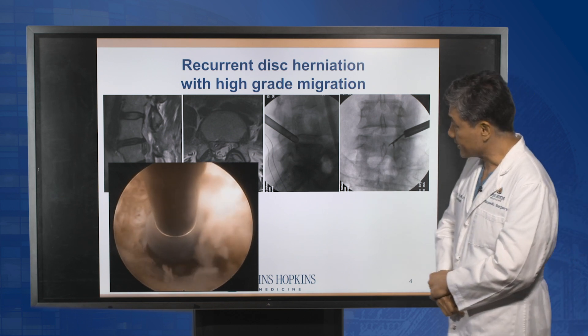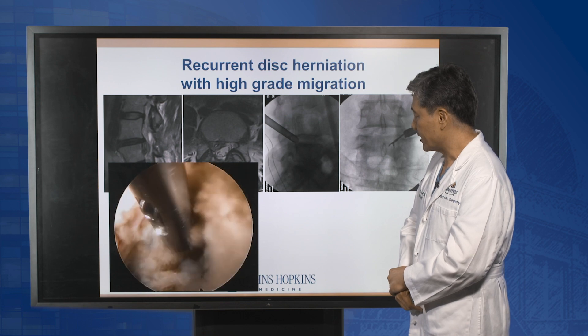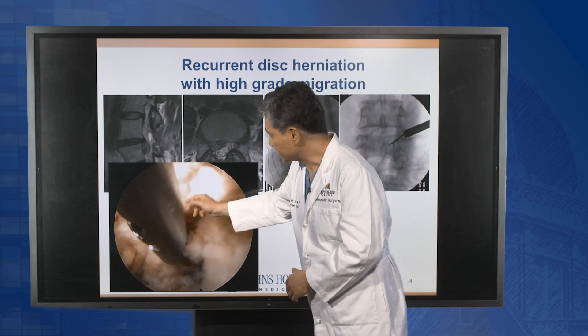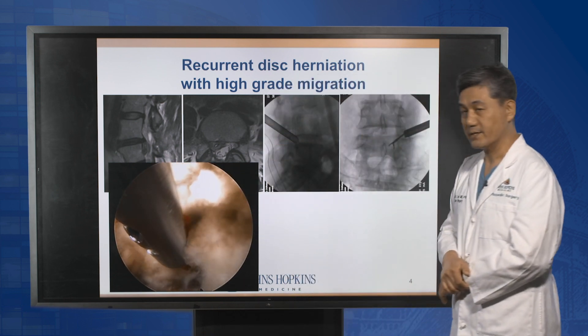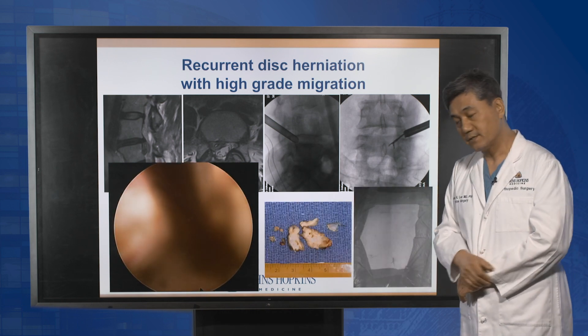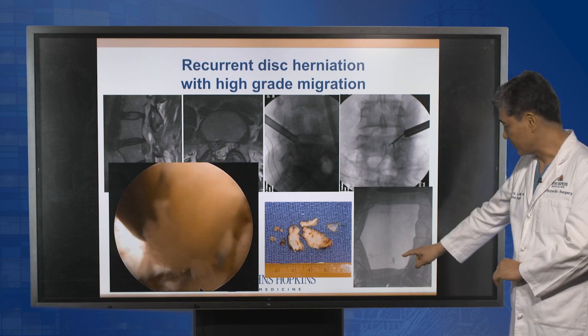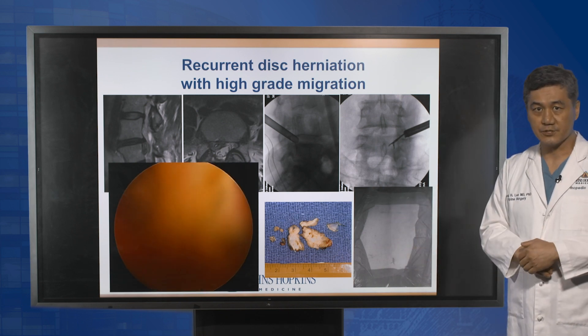This is a surgical video from the operating room. We can visualize the disc herniation and nerve root very well. These pictures show the ruptured disc fragment, the old midline skin incision, and the new endoscopic 7 mm incision.